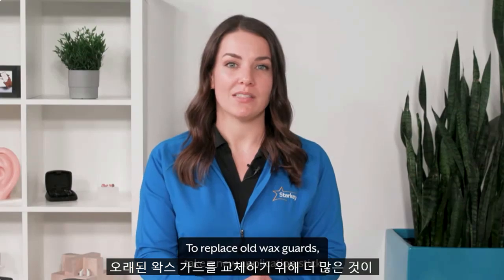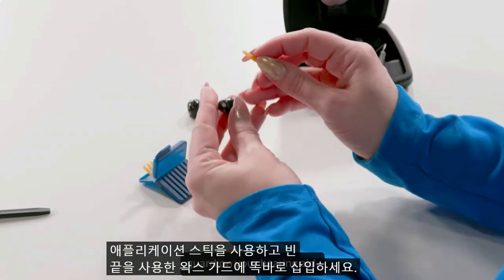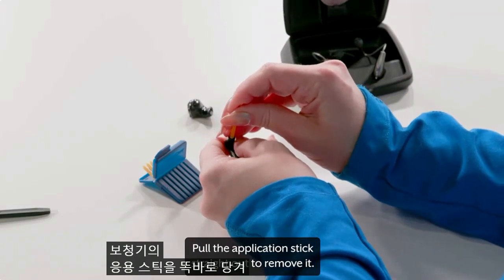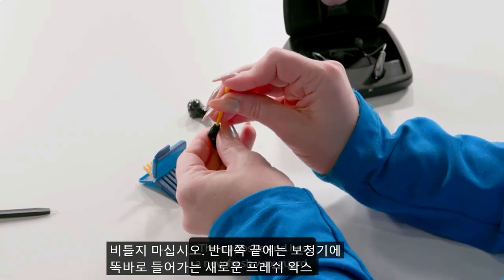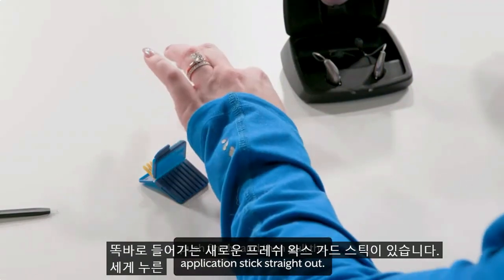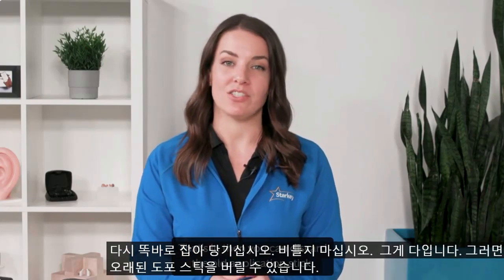To replace old wax guards, take a new application stick and insert the empty end straight into the used wax guard on your hearing aid. Pull the application stick straight out to remove it. Don't twist it. The opposite end has a new, fresh wax guard. Stick that straight into your hearing aid, push firmly, and then pull the application stick straight out. Again, don't twist it. That's it, then you can discard the old application stick.